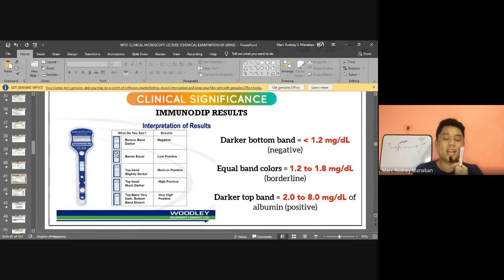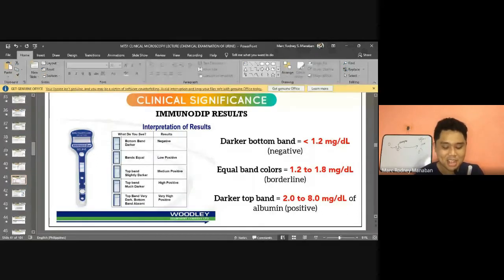So that's for the immunodip. So immunochromatography yapon siya. Alright? Na principle. Whew, I hope na-get lang to siya, dears. Sana naman nakasabot ra sa explanation.